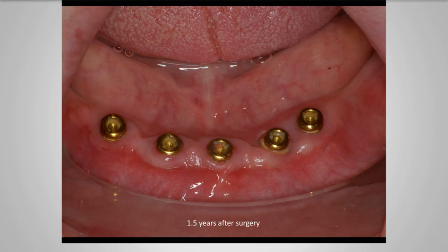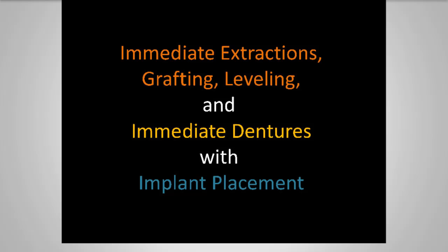Here we see the housings, or excuse me, the locators 1.5 years later. Notice the gingival tissue is very healthy around the locators. The patient is not doing the greatest job of keeping the food from getting in there, so we went over instructions with this patient to go ahead and clean out the internal aspect of these housings. Let's take a look at another case.